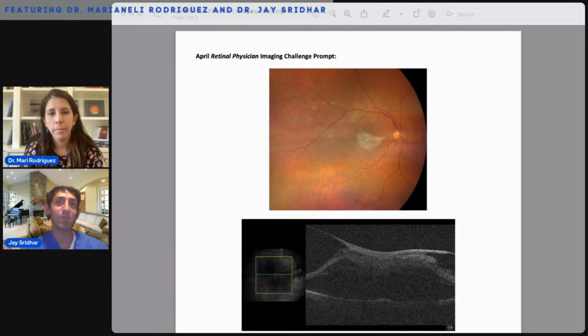It's an interesting question, Mari, because I said it's the most common procedure that vitreoretinal surgeons do in the United States. That being said, I tell patients the vast majority of epiretinal membranes don't end up in the operating room. Now with OCT, we find more and more of these membranes that don't really affect vision or are stable for a long time and don't necessarily merit removal. At the same time, we get referrals as retina specialists for the epiretinal membranes that are progressive, that are causing visual issues such as distortion, blurry vision, or metamorphopsia, or distortion of straight lines. And for those patients, I do have the discussion about surgery.